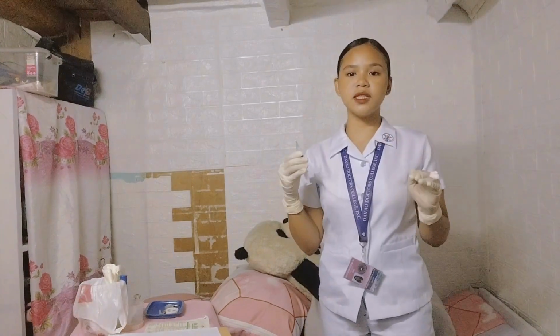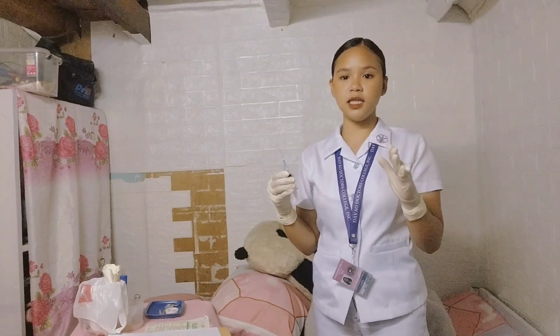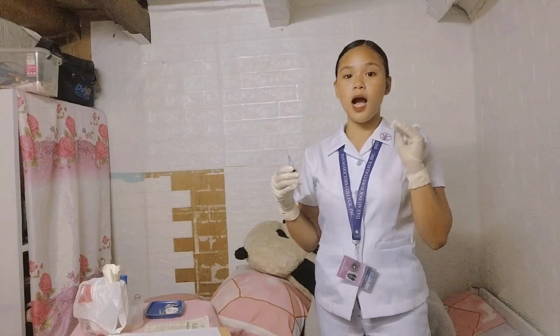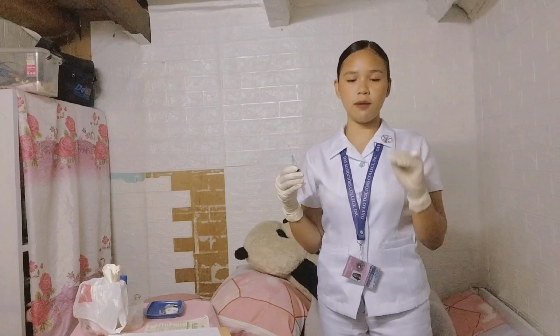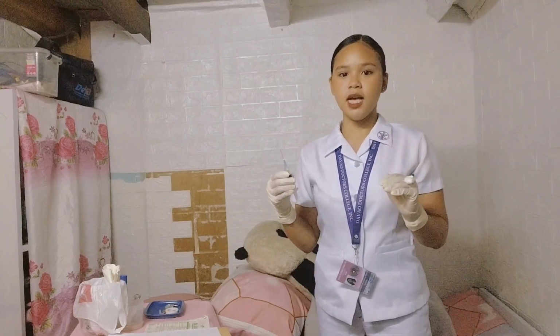And now inject the medication using the Z-track technique. Using the ulnar side of the non-dominant hand, pull the skin up approximately 2.5 cm to the side. Under some circumstances, such as an emaciated client or an infant, the muscle may be pinched.